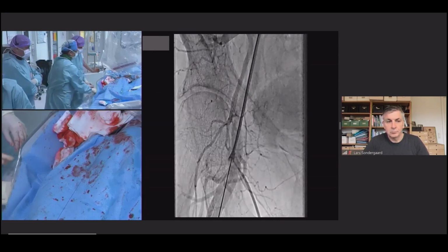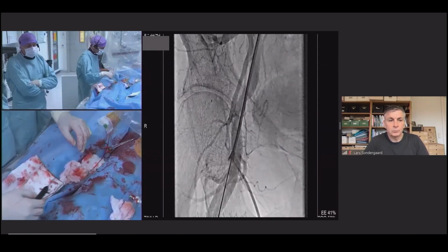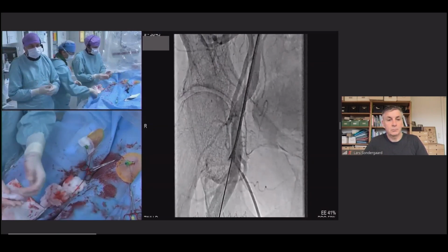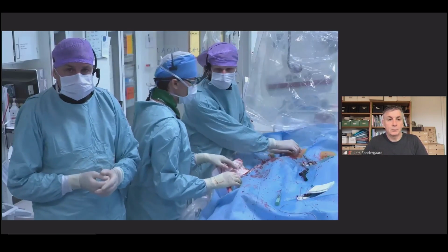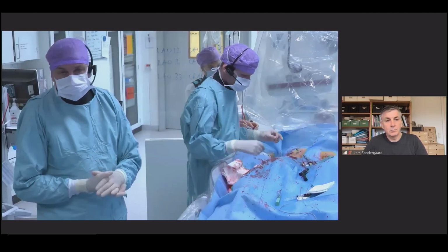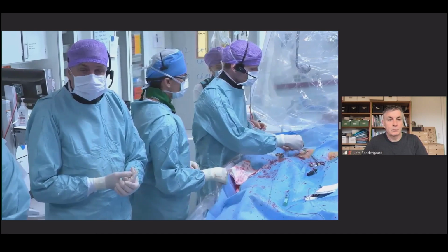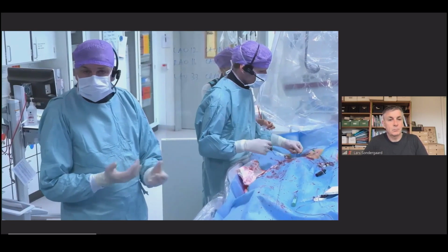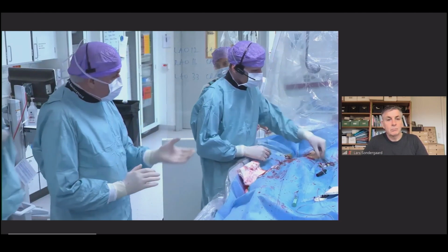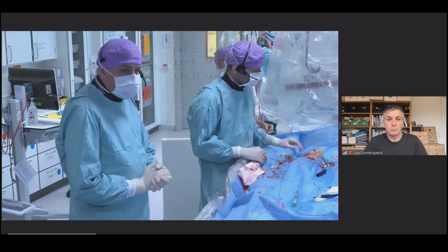Fine. So nothing else needs to be done here? No. So again, I think we complete this case. You saw it's a very challenging anatomy. It's first of all a small anatomy. It's important to make sure that the patient will not have patient-prosthesis mismatch. Using a self-expanding technology will ensure the best hemodynamic performance and probably also the best durability. You saw how calcified the aortic valve was, and with this valve, it actually did a very nice job, only trace to mild PVL afterwards. The inline sheath makes it 14 French compatible and a very smooth procedure here, no vascular complications.